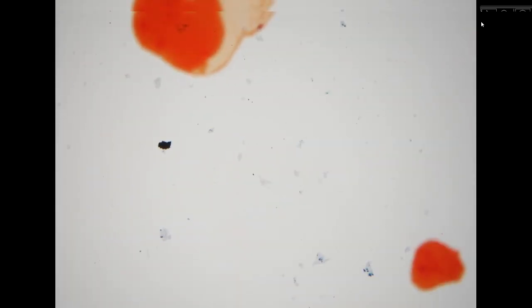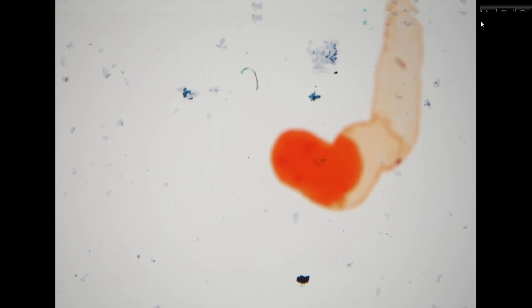This is the second specimen. In this pancreatic aspiration, the cells are pretty scant, unlike the prior case.